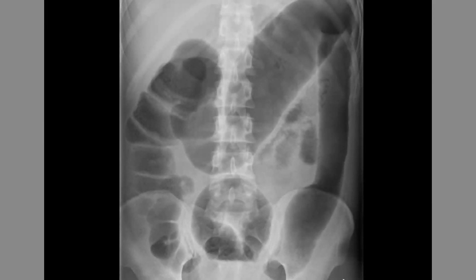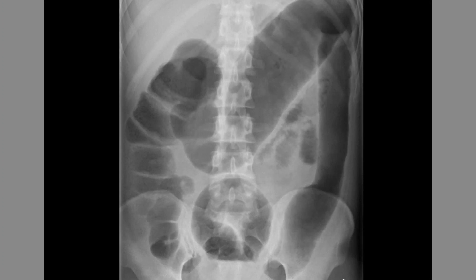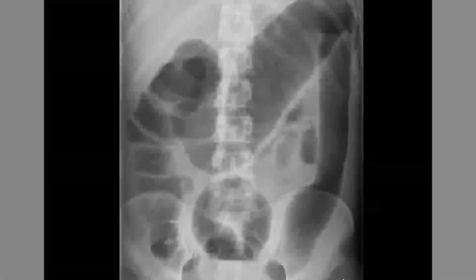This abdominal radiograph shows megacolon — specifically non-toxic megacolon without any mural abnormalities. You can appreciate the dilated large bowel: the ascending colon, transverse colon, and descending colon are all visible. However, looking inside, there is no mural or mucosal abnormality. This type of megacolon is therefore classified as non-toxic megacolon without mural abnormalities.